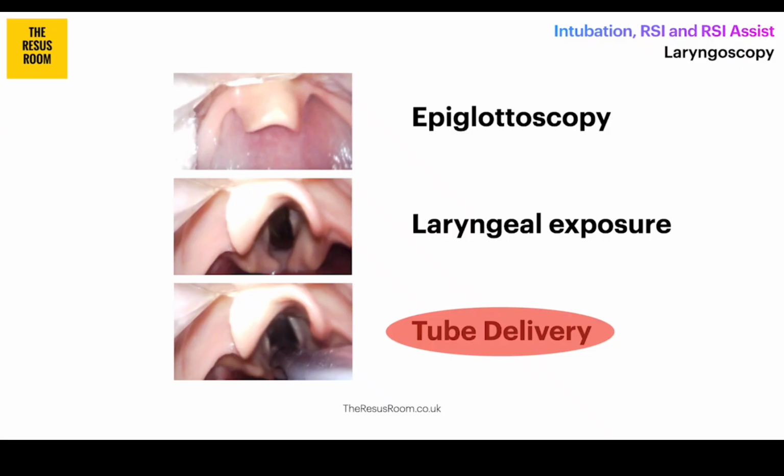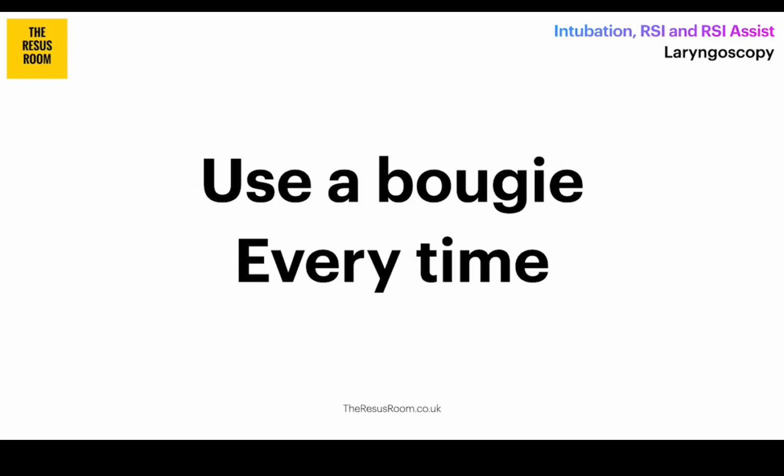Now, there's some really good literature, especially from Driver, that supports the use of a bougie in an emergency intubation, not just as a rescue, but as a planned technique to increase your first pass success. So we'll be recommending using a bougie here pretty much every time without exception.